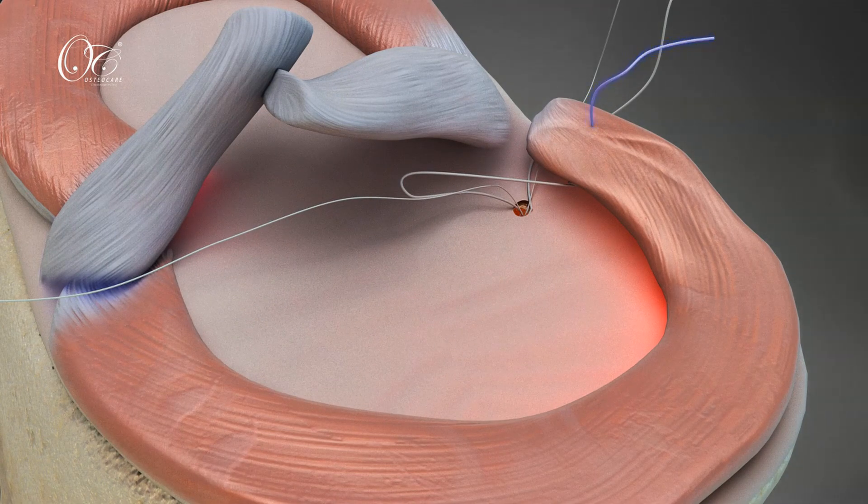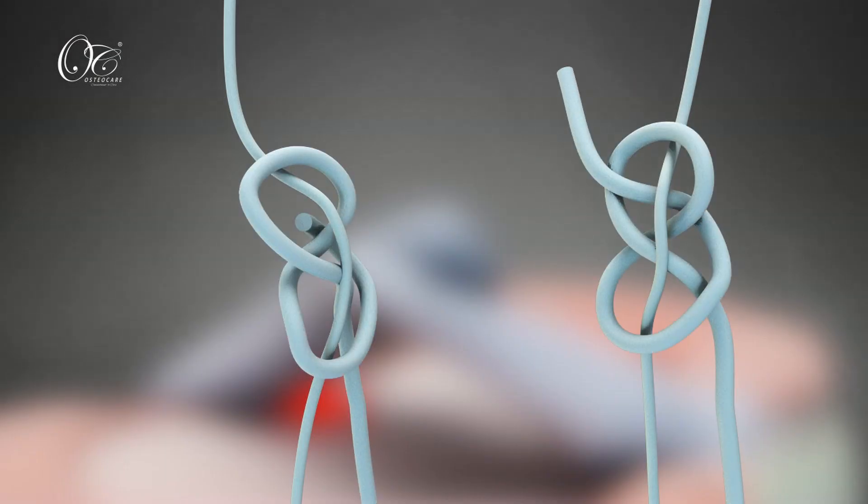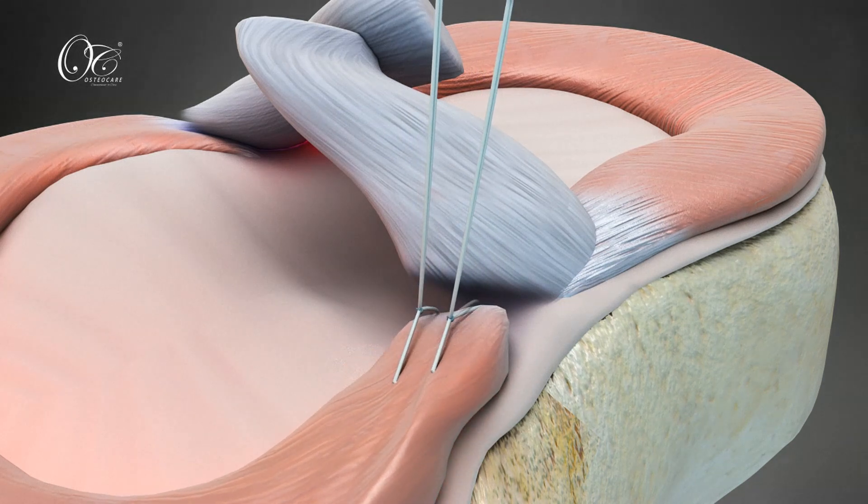At this stage, reduction is attempted by reducing the root to its native position. Both fibers are then tied over the meniscus, and the final knots are locked using the knot pusher.